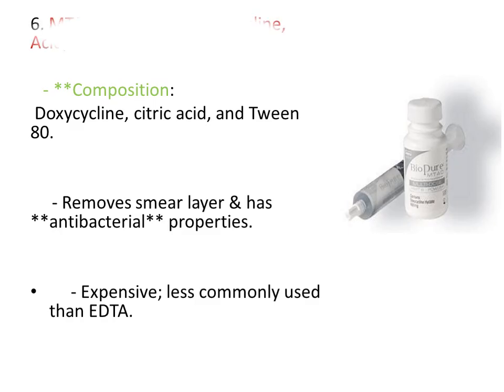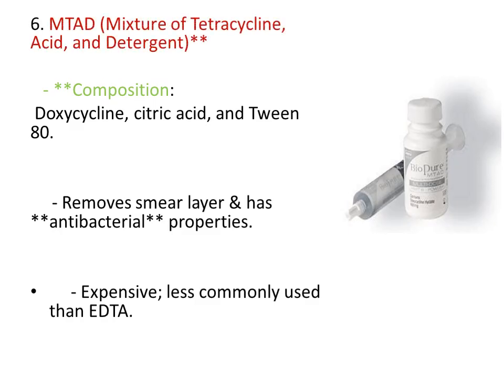The next one we can use is MTAD, that is a mixture of tetracycline, acid, and detergent. Its composition contains doxycycline, which is an antibiotic, then citric acid and Tween 80. This composition is very helpful to remove the smear layer, and it also has antibacterial properties due to the presence of doxycycline.